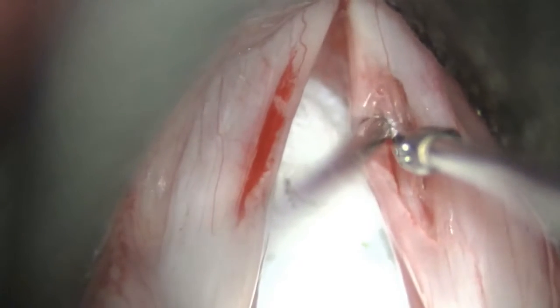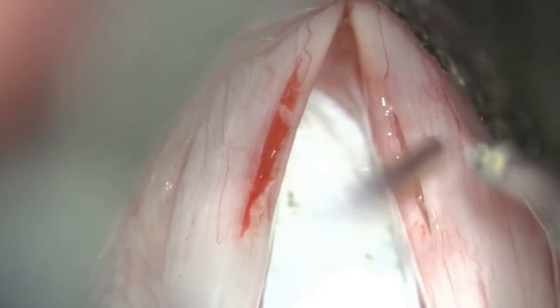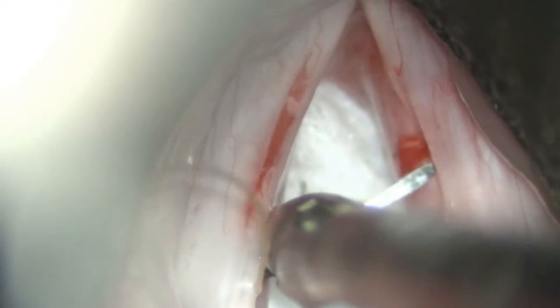The fascia needs to be laid flat in the pocket without any areas of extrusion. Often the temporalis fascia will stick to the tissue grasper, and a second instrument would be needed to hold the fascia in place as the grasper is removed, so as not to unintentionally pull out the fascia.